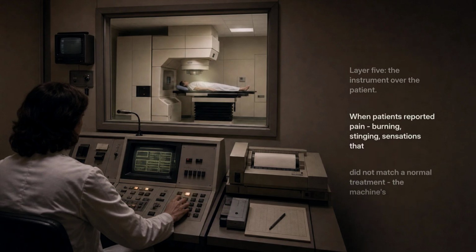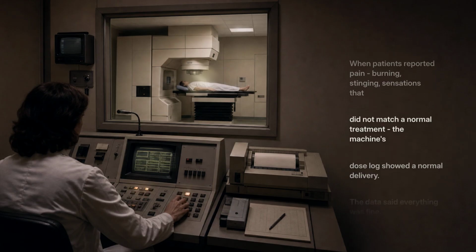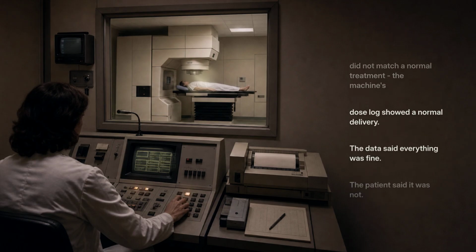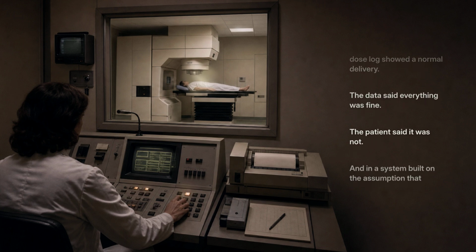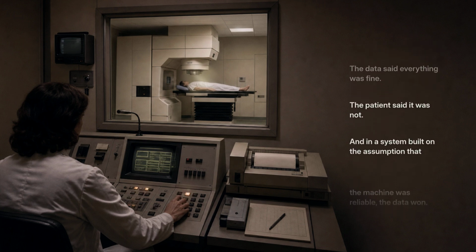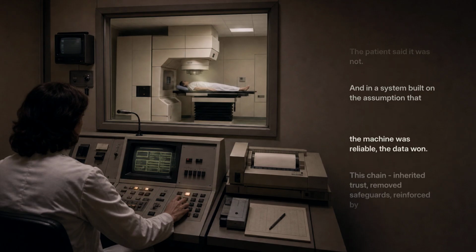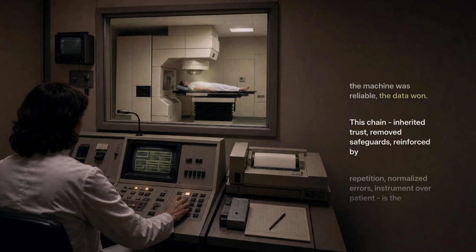Layer 5. The instrument over the patient. When patients reported pain, burning, stinging, sensations that did not match a normal treatment, the machine's dose log showed a normal delivery. The data said everything was fine. The patient said it was not. And in a system built on the assumption that the machine was reliable, the data won.